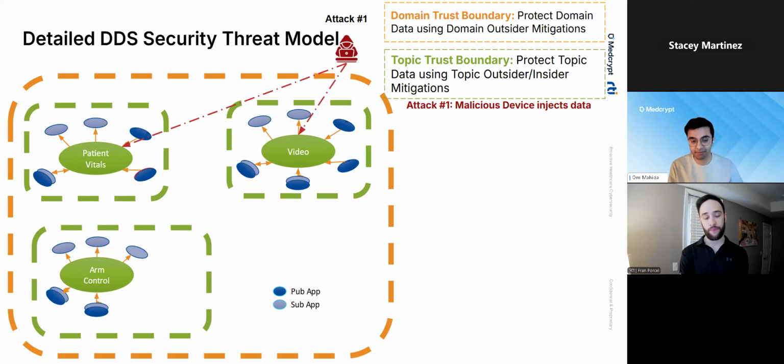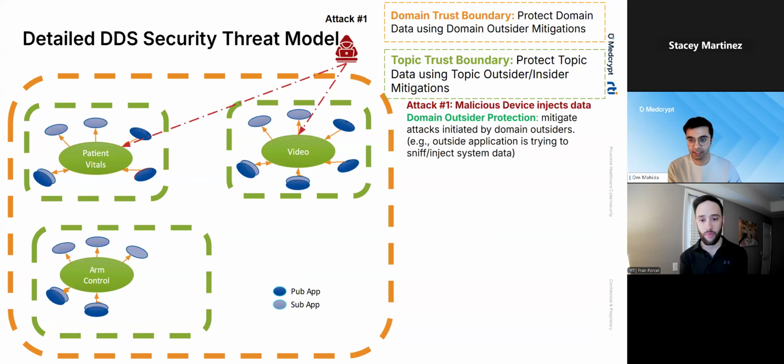Something that comes to mind, thinking years ago, is if you have a secure connection, one that's using mutually authenticated endpoints, each endpoint is verifying. It's signing data as it sends it, and then the other endpoint is verifying data as it receives it. If anyone tampers with that, from a cryptography perspective, the signature verification will fail. And so you could have protections on each endpoint that say, this is the procedure to follow when a signature fails, and you make sure each set of data sent back and forth is being verified.